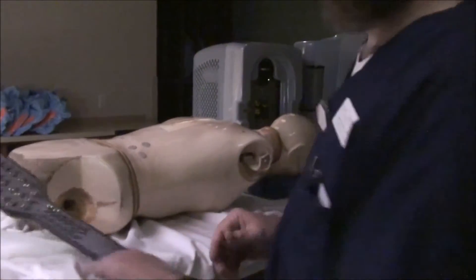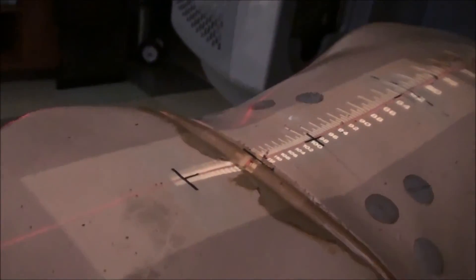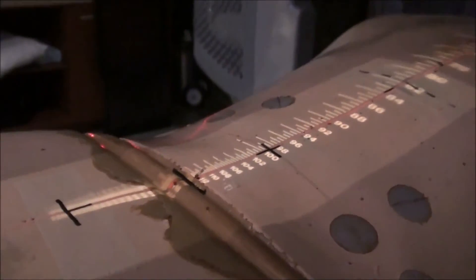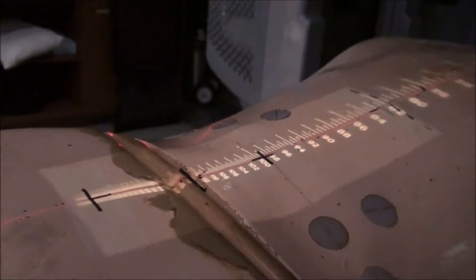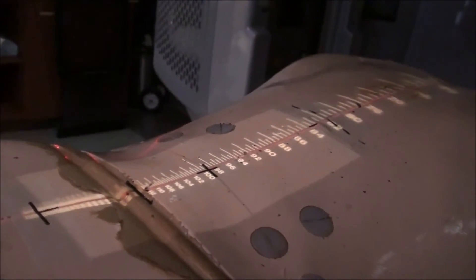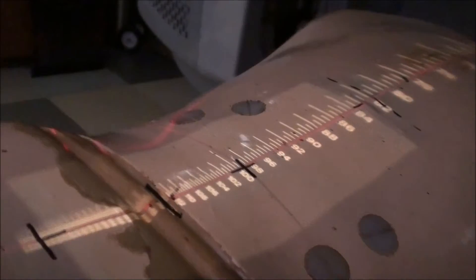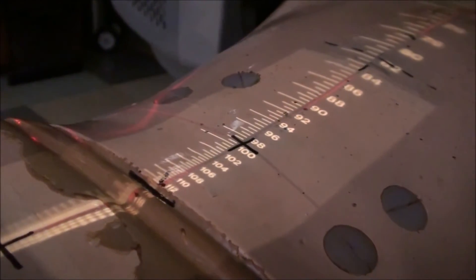Now we're going to move the patient again. Move in and out to about that CR, then set your field size. You can see that when we moved in and out with our slope, we're sitting at a different depth. For instance, if we forgot to set our depth and then tried to do a match line — let's say we're going to match directly to this match line — we would have an error.